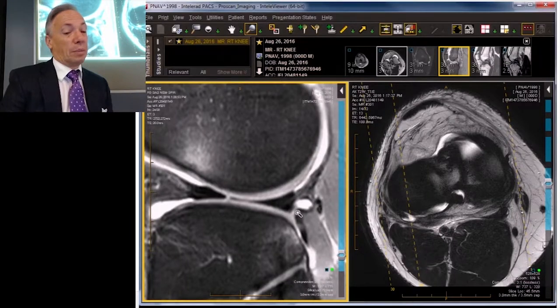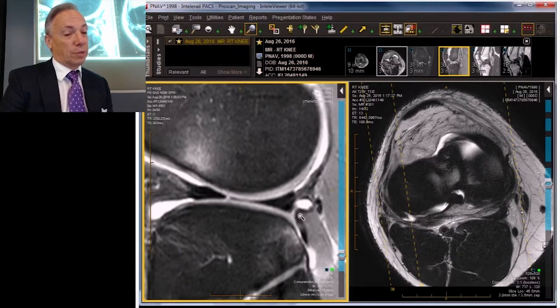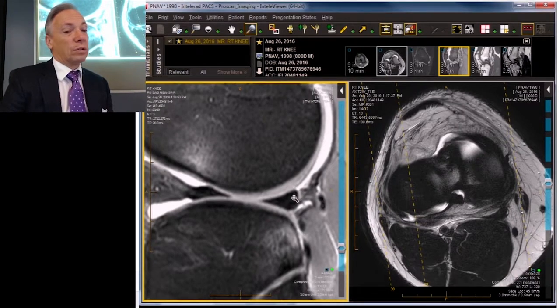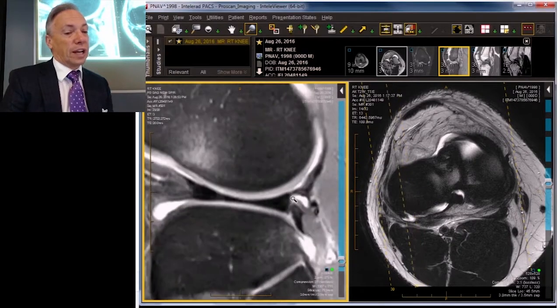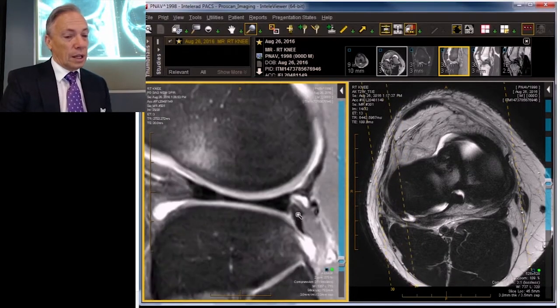If you keep scrolling — right there — there's no attachment between the popliteus, the capsule, and the meniscus. There should be a perforating linear structure coming back from this triangle inferiorly and from this triangle superiorly. So the posterolateral menisco-capsular and popliteal attachments have torn.